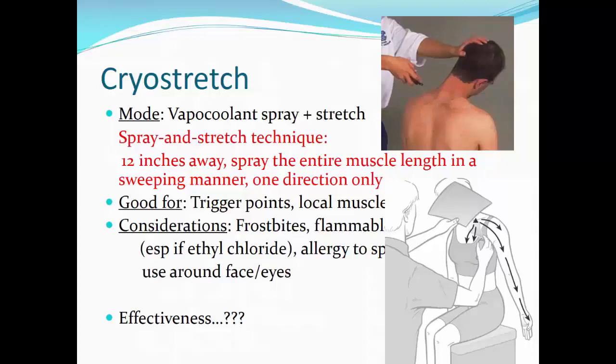The vapocoolant may also be flammable, so be careful when using this treatment if you are on a sideline close to heaters or if the patient is a smoker. The risk of flame is increased if the vapocoolant spray includes the chemical ethyl chloride. In addition, the patient may be allergic to the spray.